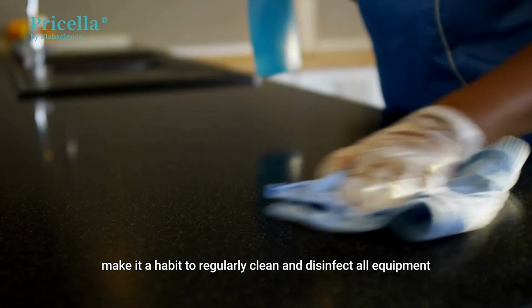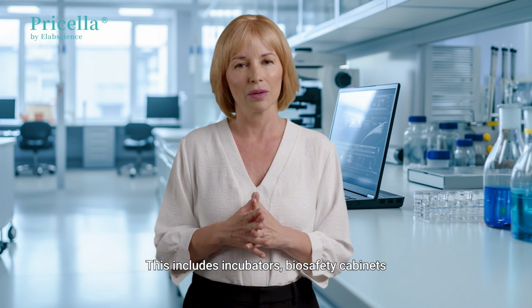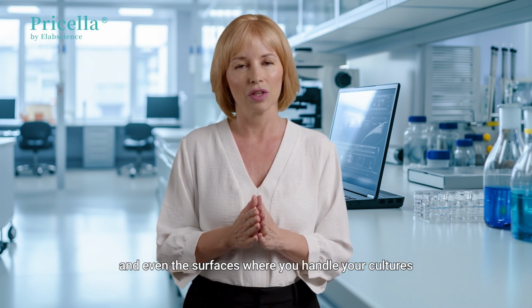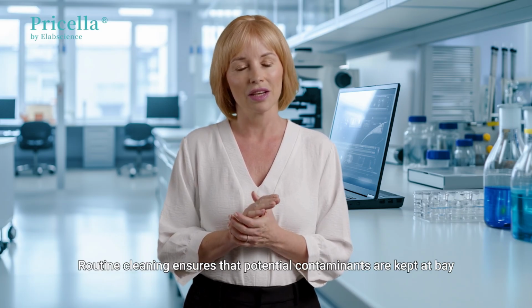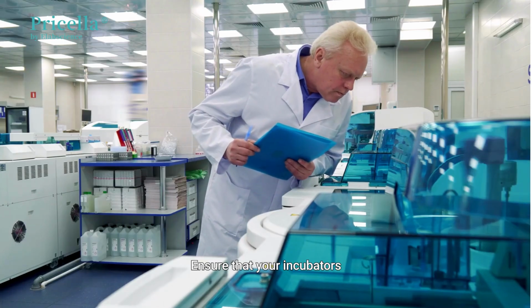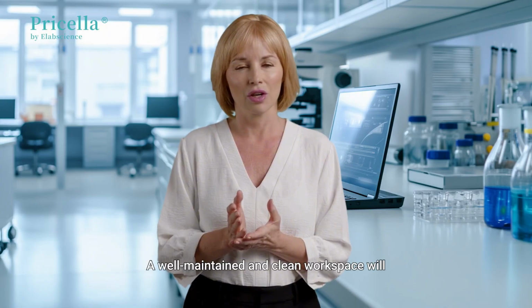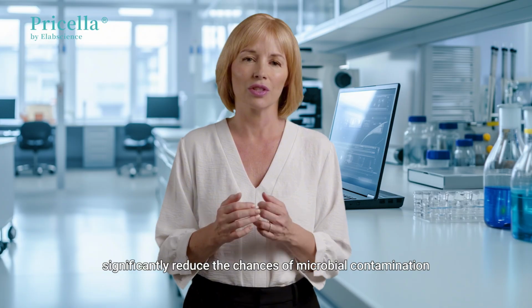Additionally, make it a habit to regularly clean and disinfect all equipment. This includes incubators, biosafety cabinets, and even the surfaces where you handle your cultures. Routine cleaning ensures that potential contaminants are kept at bay. Maintaining a controlled lab environment is equally important. Ensure that your incubators and workstations are kept within the optimal temperature and humidity ranges. A well-maintained and clean workspace will significantly reduce the chances of microbial contamination.